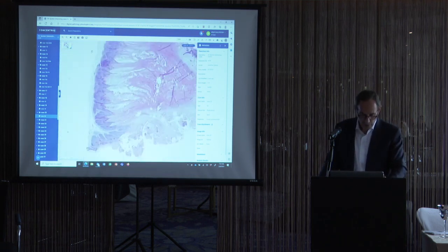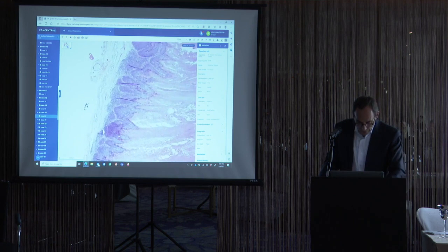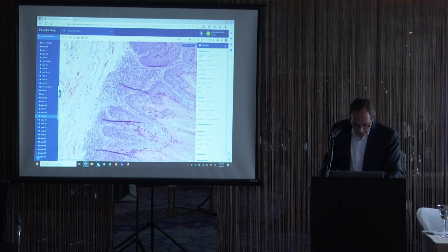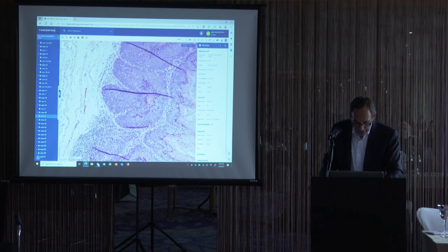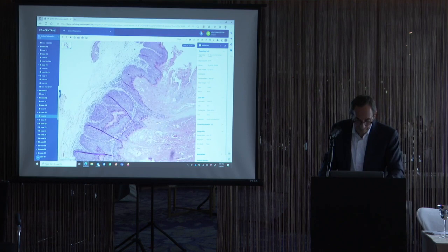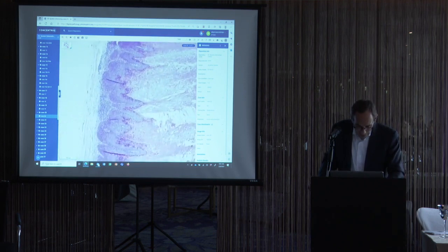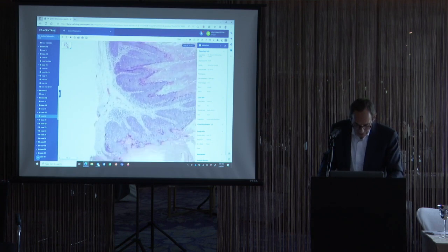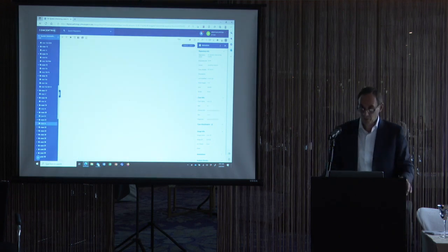You look carefully for invasion, but this is all non-invasive. Is this microinvasion, that focus you have just shown on the edge? Yeah, I think there are little nests that grow down, but not definitively irregular. Some of this is again rounded, so not definitively invasive. But it might be reasonable. Most of this looks more non-invasive. That focus, yeah. So the treatment for this lesion is just wide excision. Yep, wide excision.